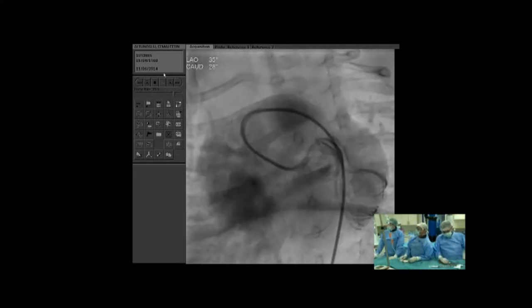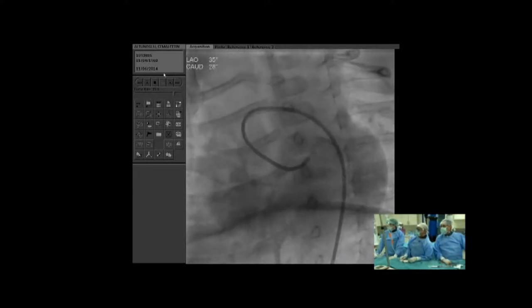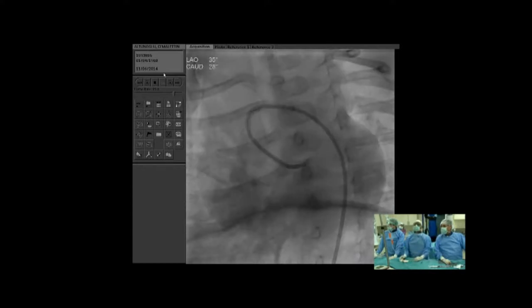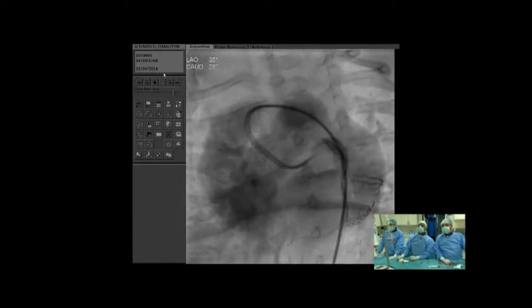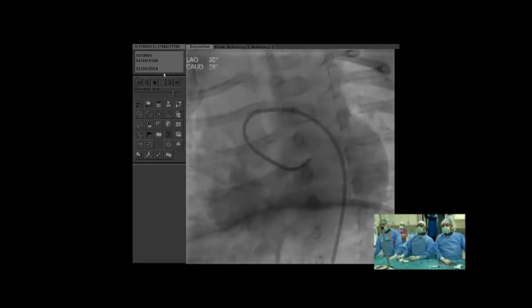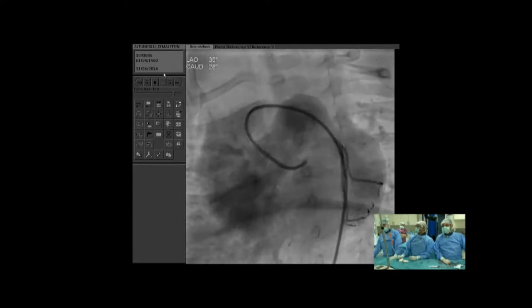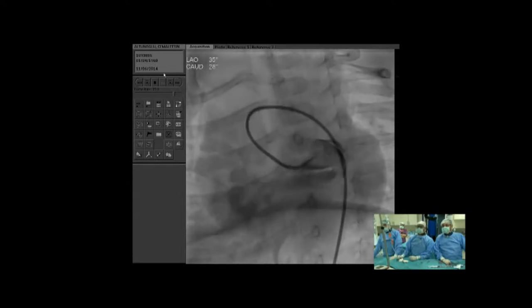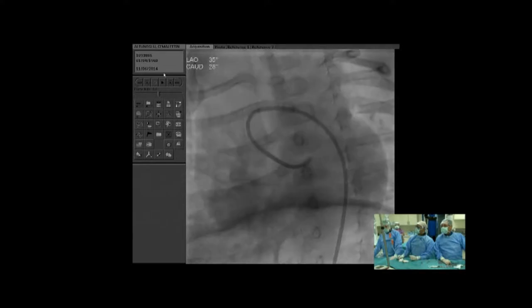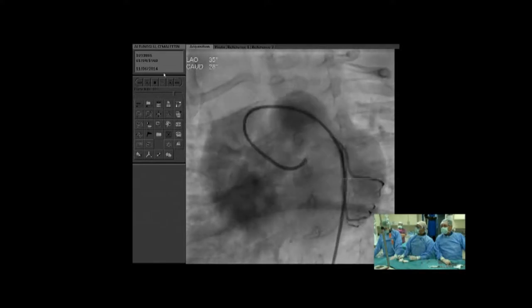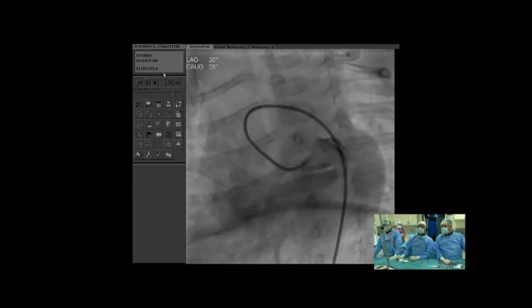Can you see the angiogram on your screen? On your screen you're probably seeing a spider view of the left coronary artery, which shows the normal coronary artery origin and the circumflex. But there's a large fistula going from the left coronary to the right atrium. It's a slightly tortuous but long vessel with a smallish, probably 3 or 4 mm opening. Do you see that? Yes, it's very clear.